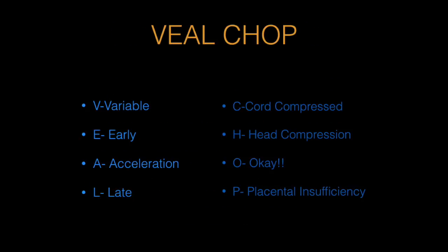VEAL CHOP is a quick mnemonic used by nurses all around to remember the correlation between each deceleration and their most common complication.